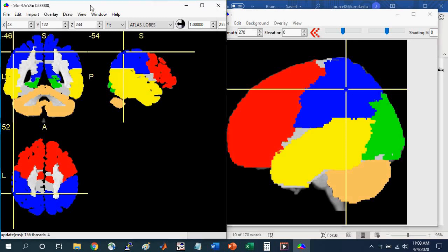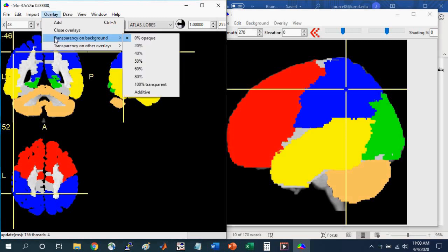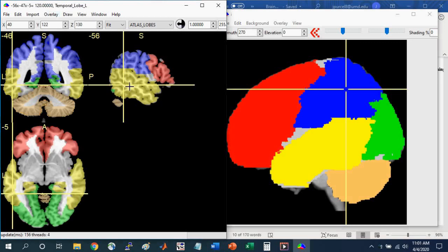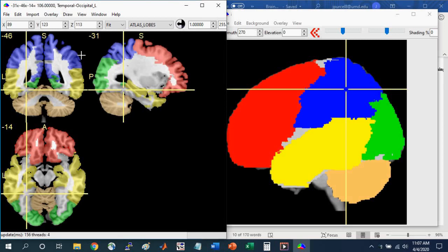Another thing you can do in the slice view window is change the transparency on these overlays. So you can go to Overlay, Transparency on Background, and let's say we'll change it to 60%. Now you can still see the colors here in the left temporal lobe, but you can see the underlying structures such as the sulci and gyri. As somewhat of a side note, you might notice that some of the regions are grayed out. It's grayed out because it spans both the occipital and the temporal lobe. Any region that's gray is not cleanly divided into any particular lobe. This atlas provides a nice introduction to the lobes and the cerebellum.